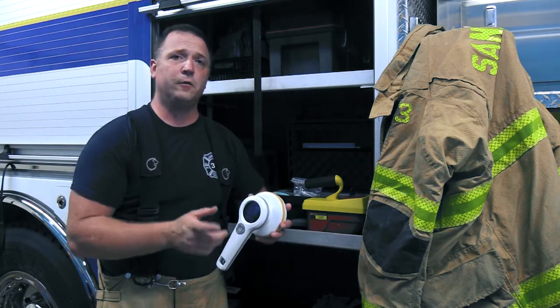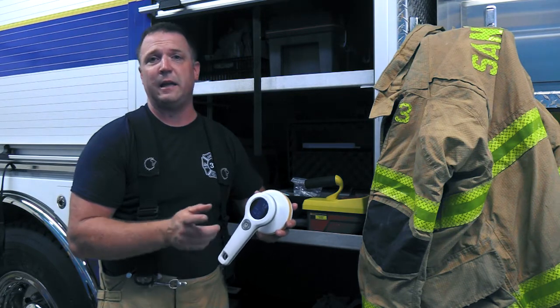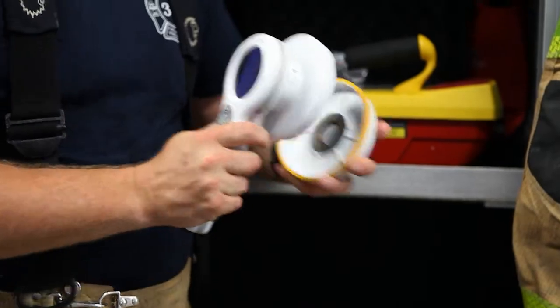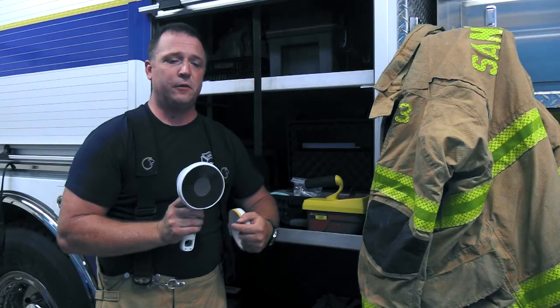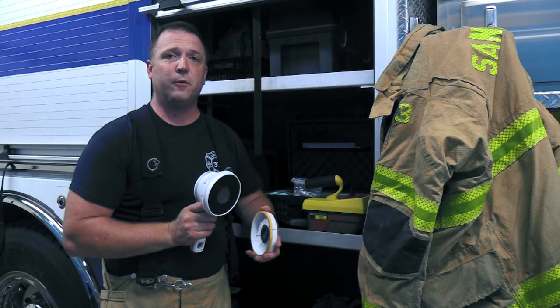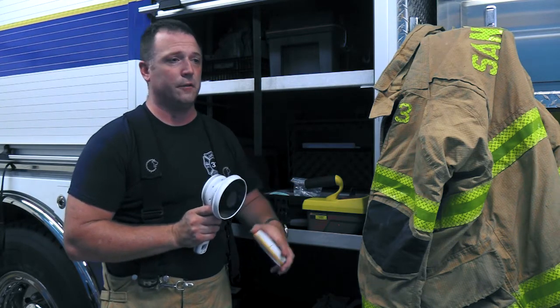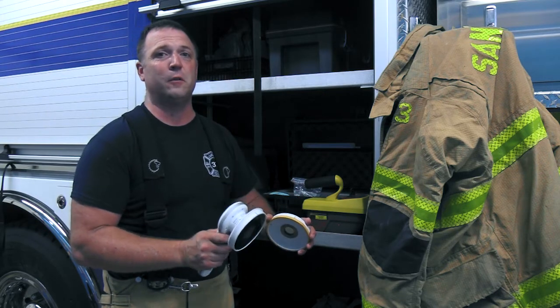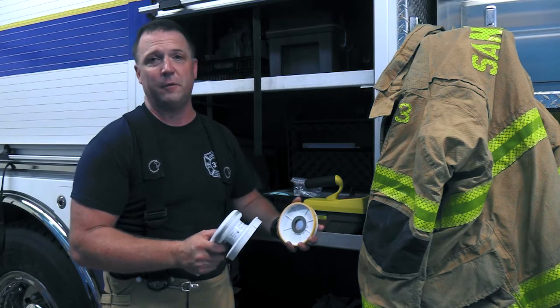The 452 measures dose and dose rate, but also energy and KEV levels, as well as counts, simply by taking off the cap. The 452 utilizes a Geiger-Mueller tube surrounded by a diode array. This means that the 452 is a directional device, meaning we're going to have to point it towards the source. This is great for emergency services, because we can help isolate where that source is coming from.